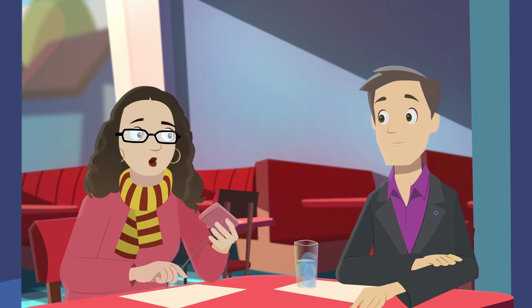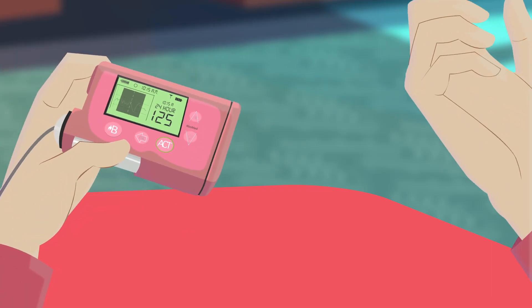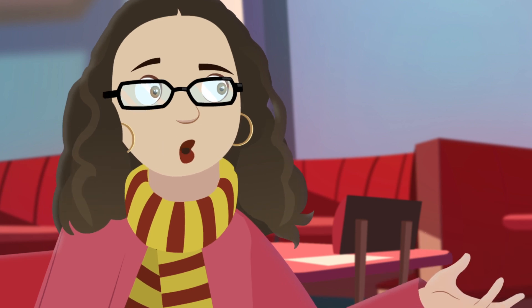I checked my BG when we got here and it was 200, but my sensor reading was 125, which is way off. So to get the numbers closer, I calibrated. And even now they still aren't close.